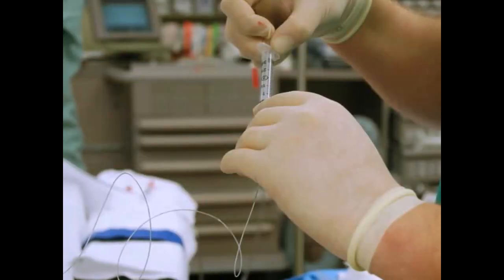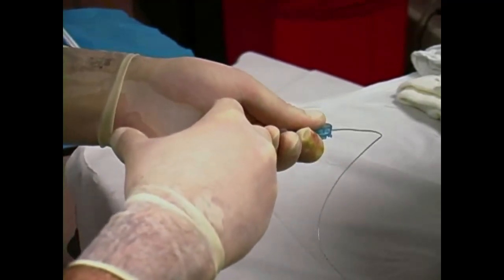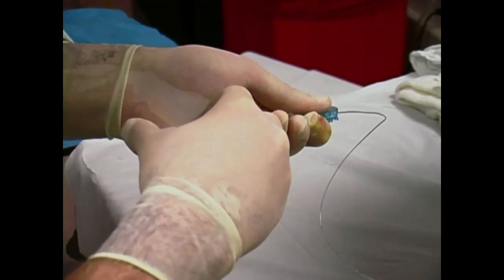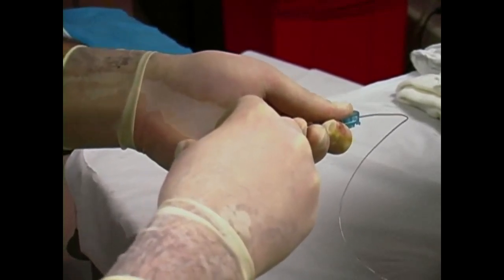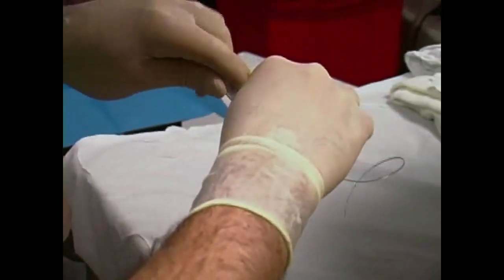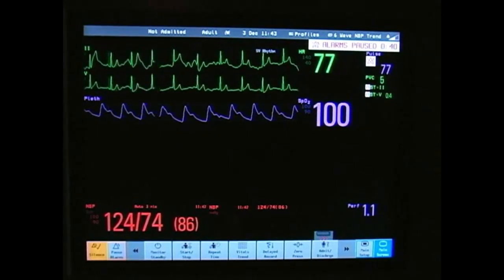Aspirate the catheter to check for cerebrospinal fluid or blood. Air bubbles or slow-moving fluid indicate proper placement. A test dose of 1.5% lidocaine with epinephrine is given following aspiration to ensure the catheter is not placed in an intravascular structure. Before injecting the test dose, notify the patient of symptoms that may be experienced if the catheter were not located in the epidural space. Also monitor the patient for increases in heart rate or blood pressure, as these are signs of intravascular injection.